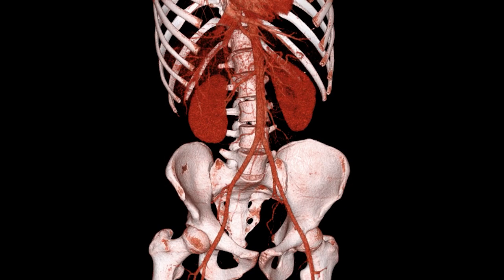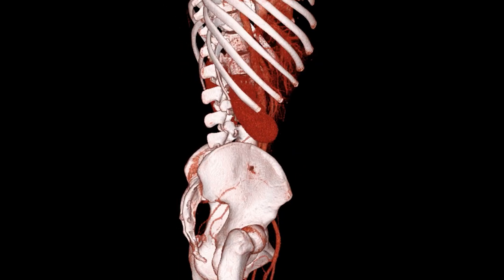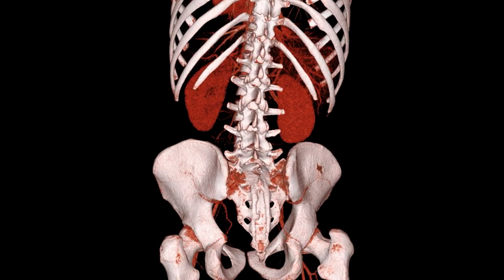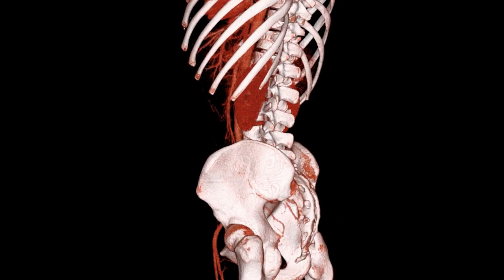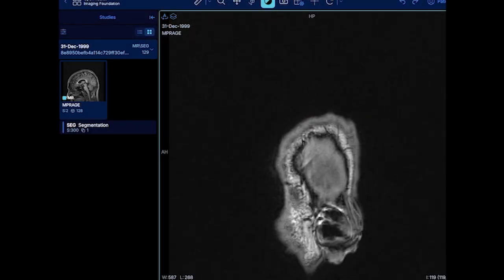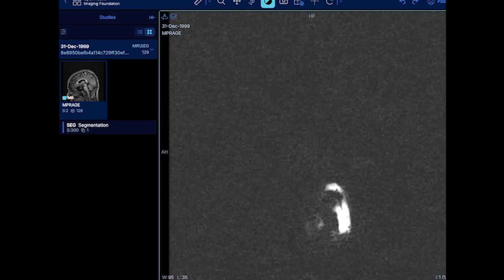A future health ops portal would sit in front of this architecture. Cognito sign-in with clinician, technician, research, and administrator roles. Simple upload and study status screen. Study list with validation import status and audit-friendly timestamps. A browser DICOM viewer, such as OHIF Cornerstone, for appropriately authorized users. Approved 3D output, preview, or download. An operational dashboard for the MSP: failed intake, quarantined files, workflow state, cost, and audit events.